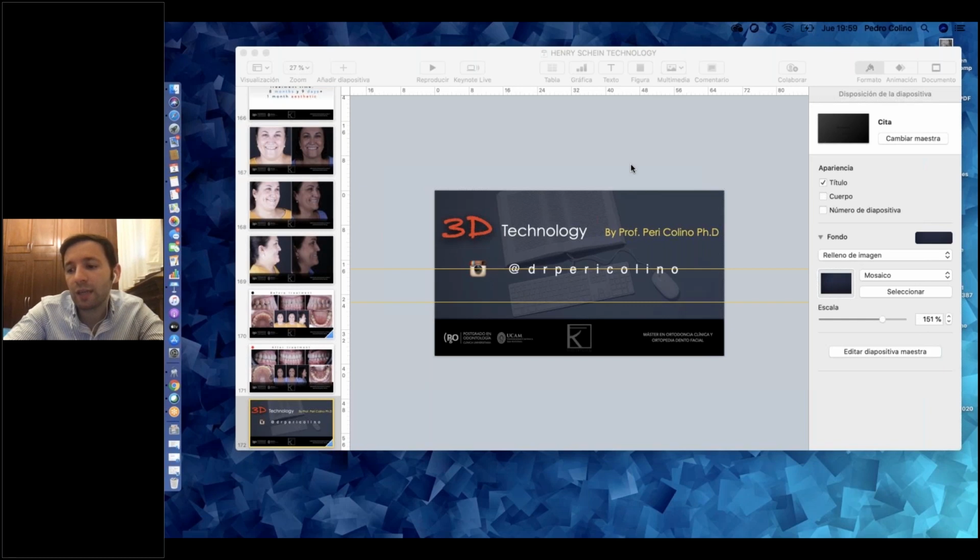I prefer to start with disjunction and class 3 motion in Spain because Spanish people, it is also true, we have lots of maxilla deficiency. If you don't see maxilla deficiency, you have to put brackets or anchorage in the upper arch and class 3 motion in the lower arch.